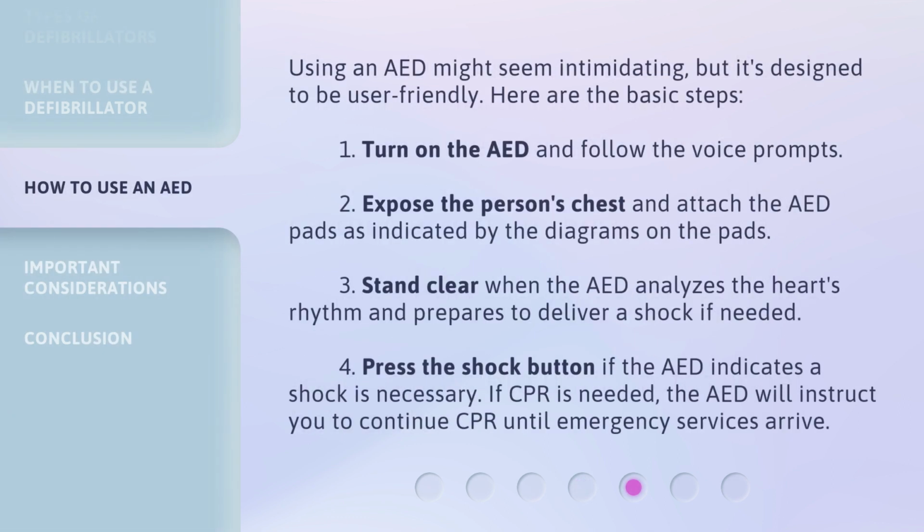Using an AED might seem intimidating, but it's designed to be user-friendly. Here are the basic steps. 1. Turn on the AED and follow the voice prompts. 2. Expose the person's chest and attach the AED pads as indicated by the diagrams on the pads.